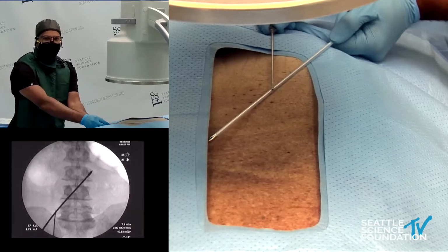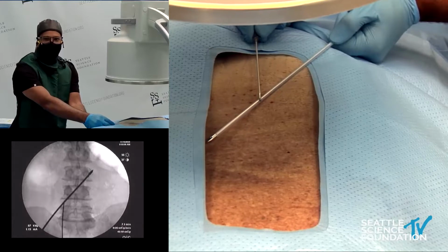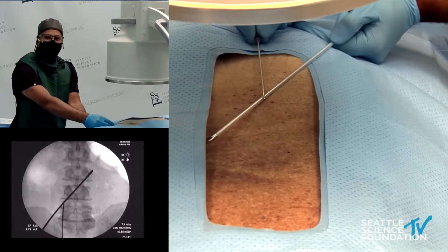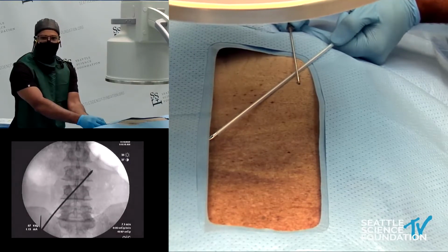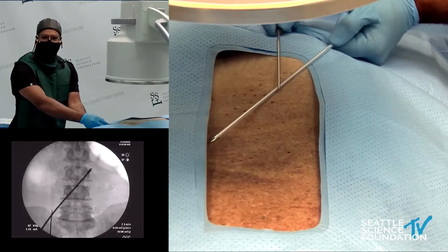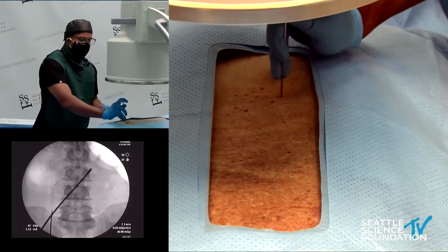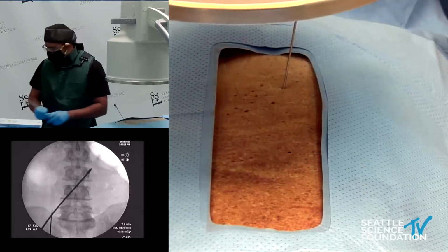And if I had a patient who was, say, 80 pounds, 80 years old, I might consider starting closer to that interlaminar space, right? Because there's less tissue between the skin and the lamina. However, if that patient were to be 300 pounds, I might start way out here because I have to traverse all of that tissue. It's really important, just like Glenn talked about, with dorsal column stimulation to stay shallow. For this particular patient, I'm going to basically start right here. And so I'll enter. Of course, I'd use local, but for our friend here, he is well anesthetized.